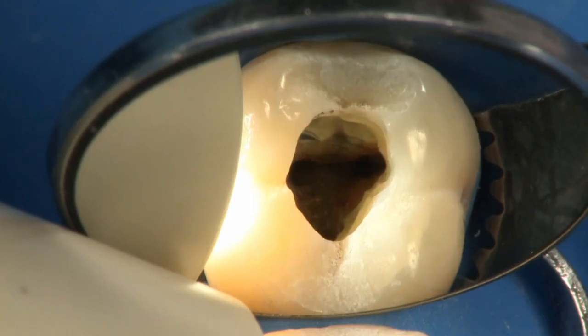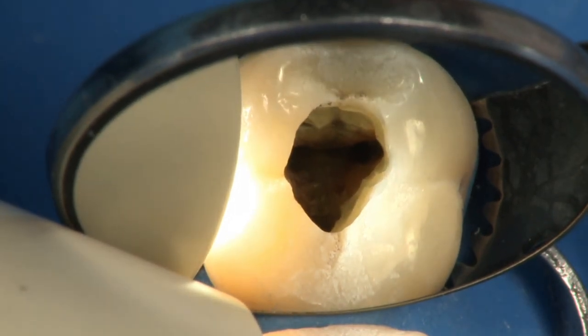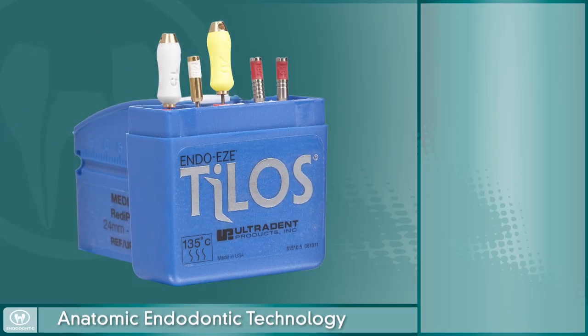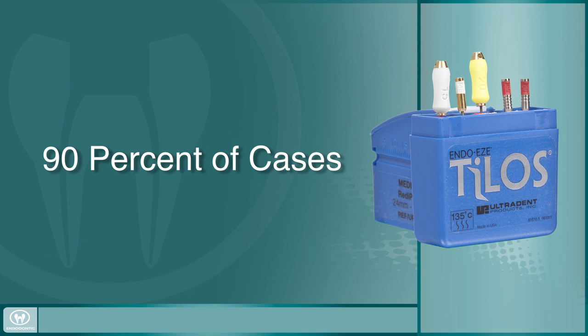Once the canals are accessed, it's time to begin instrumenting to remove all infected and necrotic tissue while properly preparing the canal for obturation. As a continuation of the anatomic endodontic technology, Ultradent has developed the Endo-EZE TiLOS file system. The TiLOS RediPak contains everything you need to reach the apex and properly instrument 90% of your root canal cases.